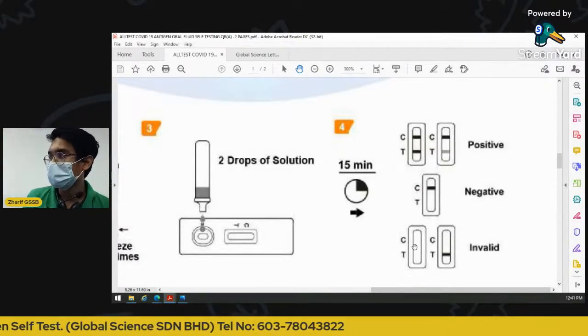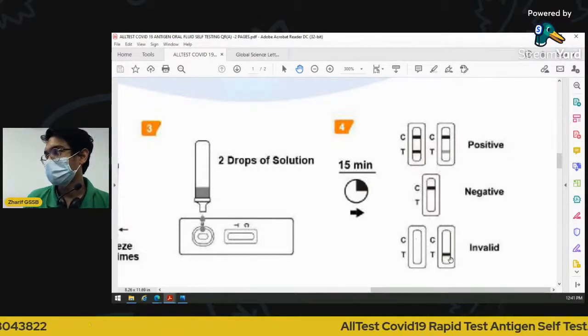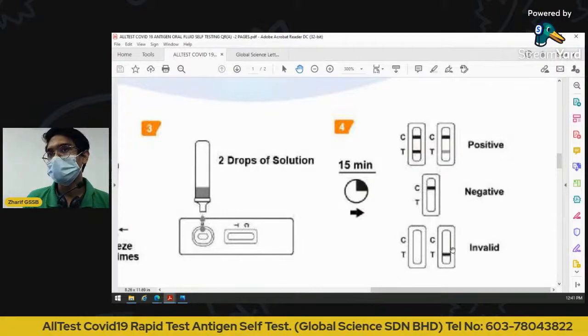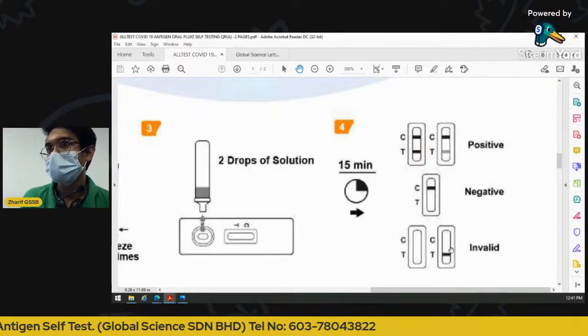And for the invalid, there is no line at all at C for both tests. But for one test, there's one line at T. Both results are considered as invalid. Even if there is a line at T, if there's no line at all at the C, then it is considered invalid.